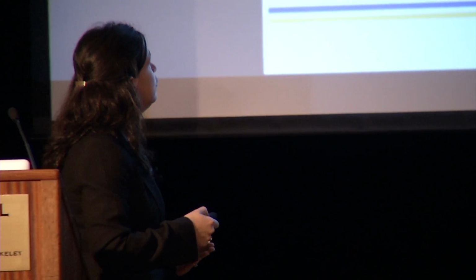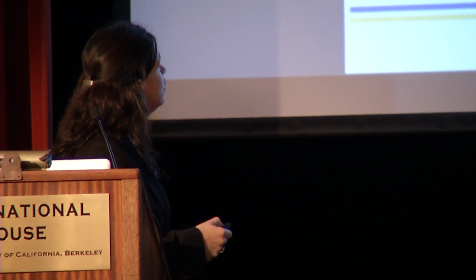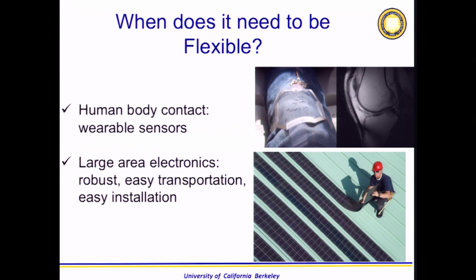But I really believe that whatever is in contact with the human body has to be flexible. It doesn't matter if it's going to be in contact with my skin or inside the body. Being flexible is a must, because our tissue is flexible and our clothes are flexible. So if we are going to have more and more wearables, which seems to be the trend, we need to make these devices flexible and more integrated with us.